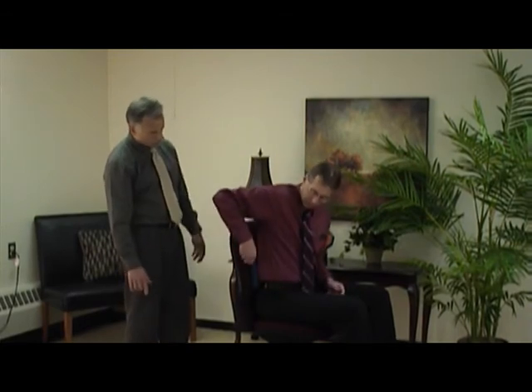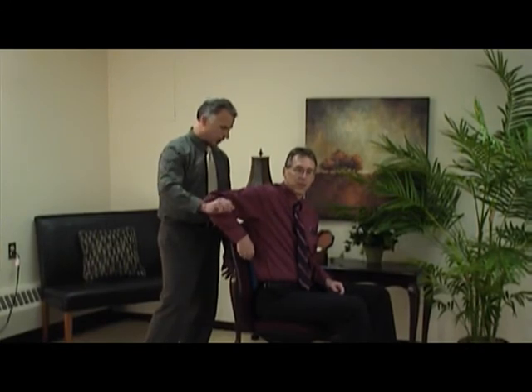Yeah, so all you do, now why don't you do this, Bob, because I'm not going to be there in your car or wherever. You simply turn it. Oh, yeah. Let the air out. Very easy to use. Now tighten it up when it feels it's at the right density. That feels good. Okay, and you leave it right there.